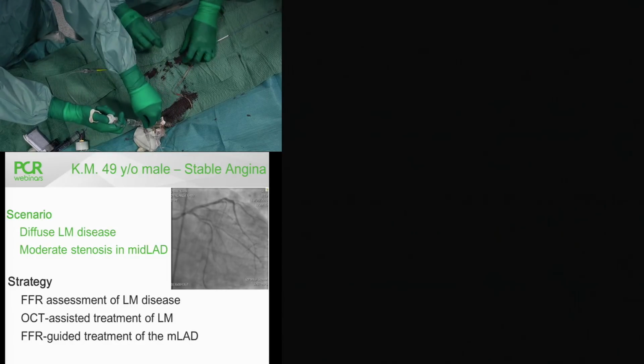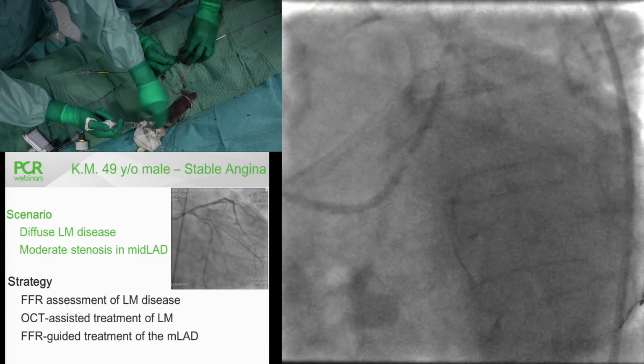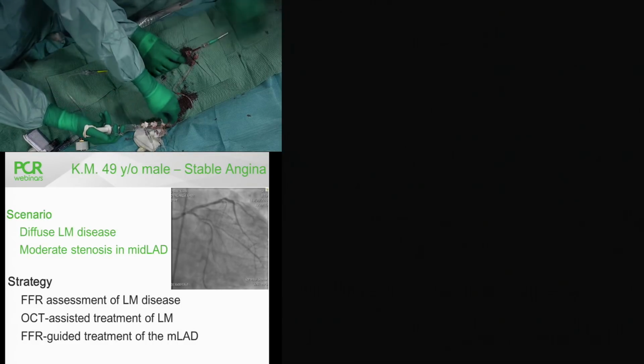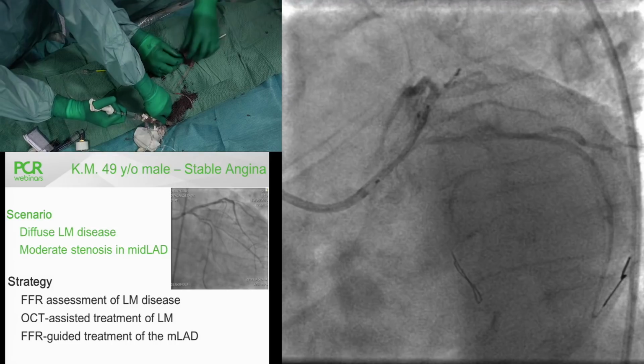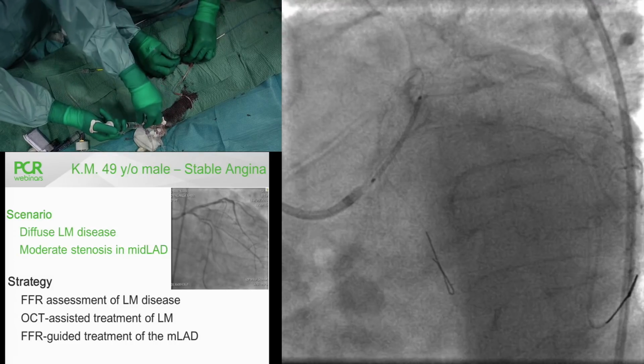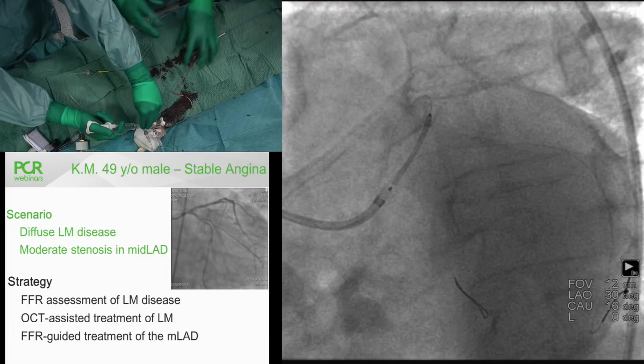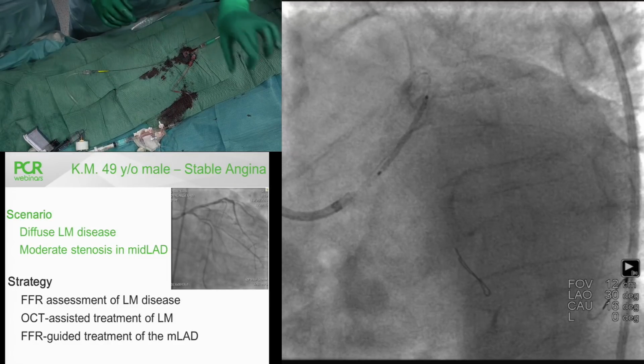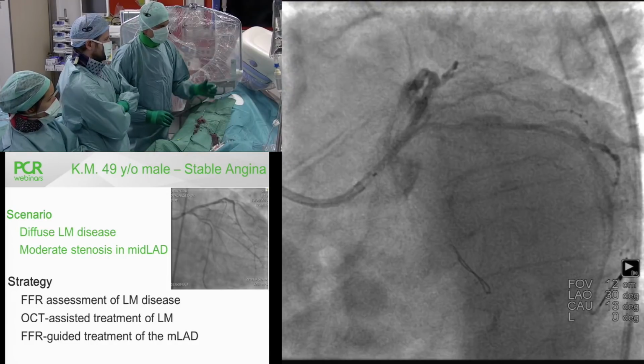Okay, test a little bit. We are going to approach the guiding. Yeah. No, we are way too deep. It's not that easy. We are hesitating. Okay, again. No.